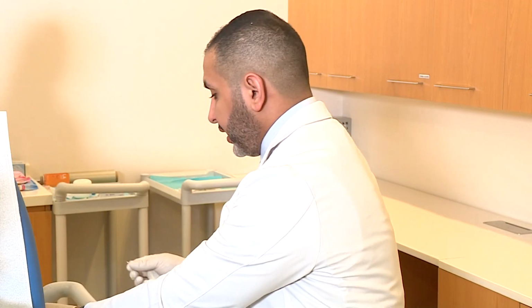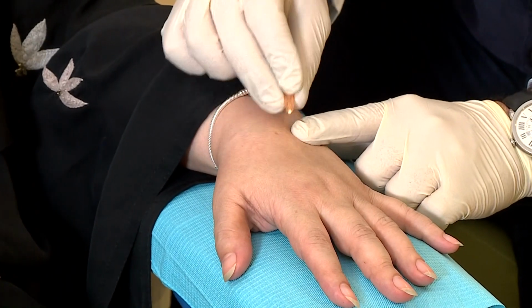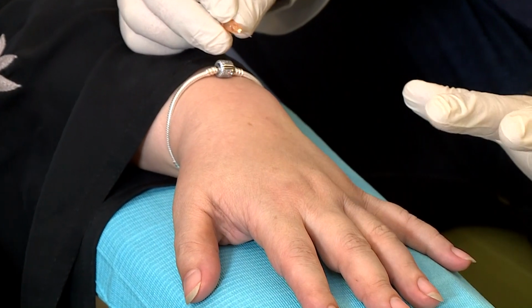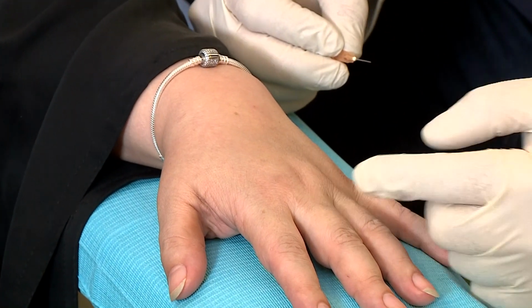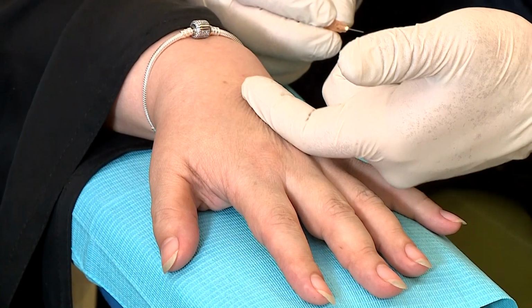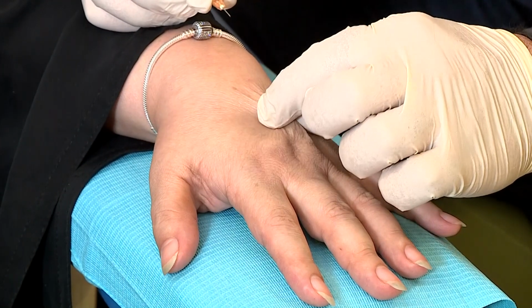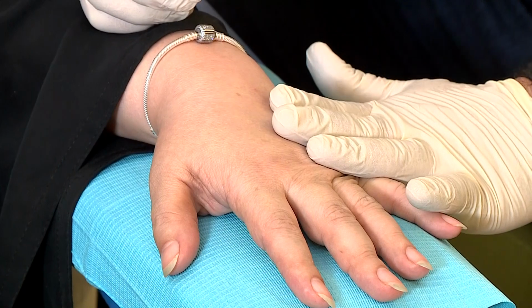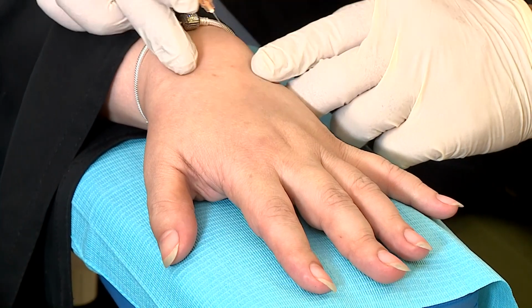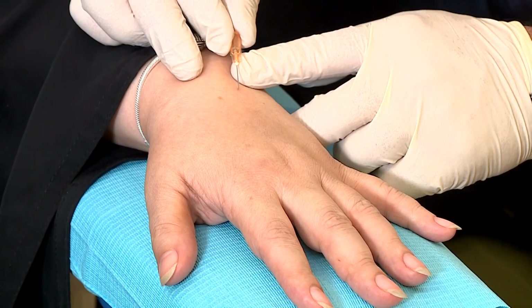We usually choose our point of entry from the area that we think will reach most of the areas that need to be injected. You can use your point of entry distally and then inject with the blunt cannula proximally, or you can go the opposite way, which is more convenient for most patients. Because we are injecting in the subcutaneous plane, you can easily choose your point of entry in an area where there are no blood vessels, and you can visibly see the blood vessels.